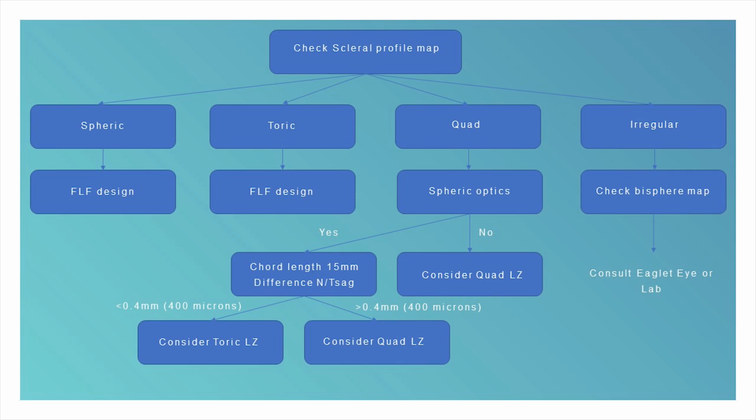This flow chart is kept as small as possible. In future videos, we will have an expert level lens fitting, and it's building upon what I've presented here.